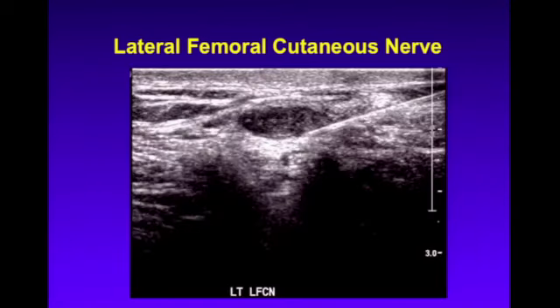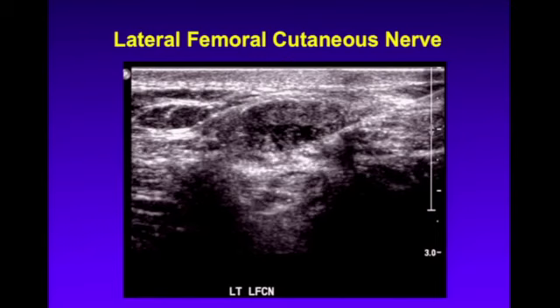And so again, we have to use the real-time advantage of ultrasound, and we're able to stick a needle around that nerve and inject some local anesthetic and cortisone, which gave him some temporary relief. He eventually went on to have alcohol ablation of this nerve with very, very good results, again, using ultrasound guidance.